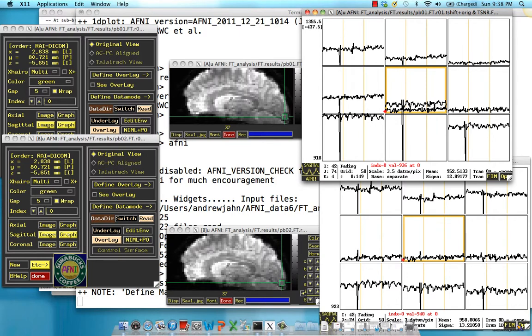We only have a couple more steps here before we actually run our analysis. This next step is something called smoothing. It's a type of spatial interpolation where we take the average of all the surrounding voxels and then use that to determine a new value for the center of the voxel.